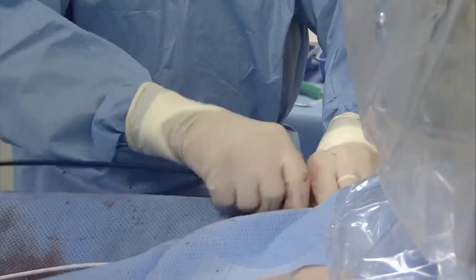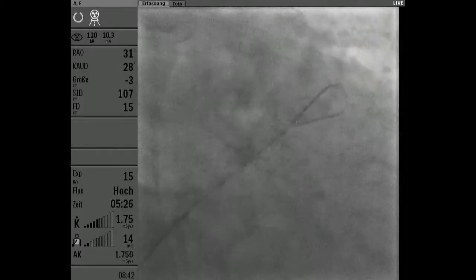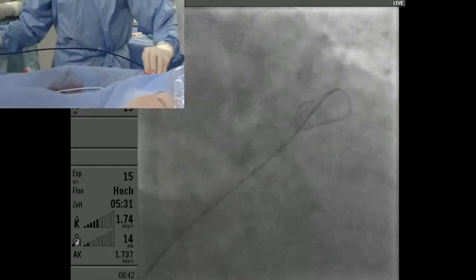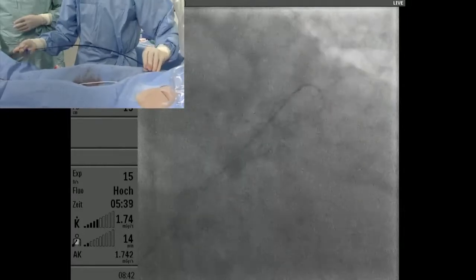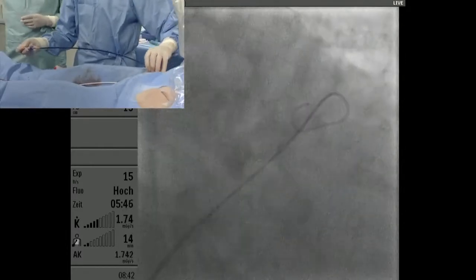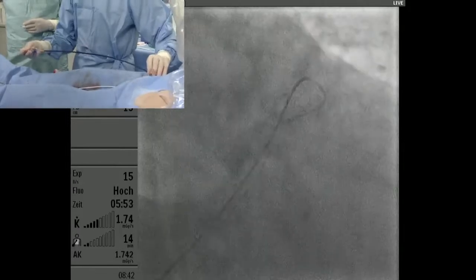Horst, why not put a primary sheath like 14 French or something like that? That's by far too expensive. It's different in your place, but yeah, it's a good idea. You mentioned that yesterday. Or you could pre-dilate with a short dilator. Yeah, that's also an option. So whenever you have problems with introducing the sheath, then you should use one of these other tricks, because when you have a kink in the wire, then it can really get complicated. And I have seen cases where the sheath was advanced in the subcutaneous tissue.